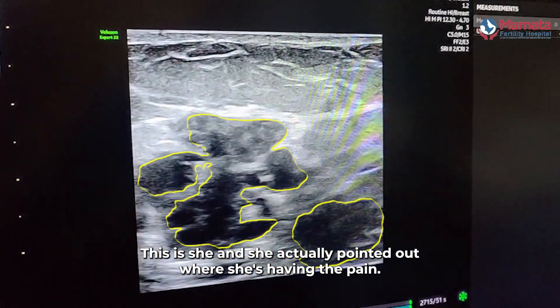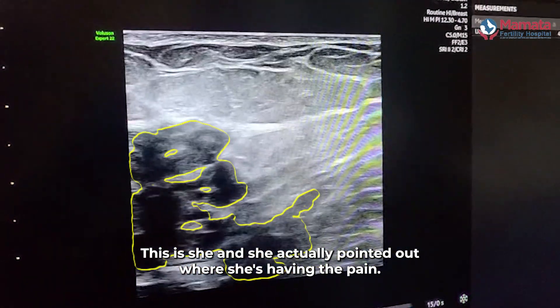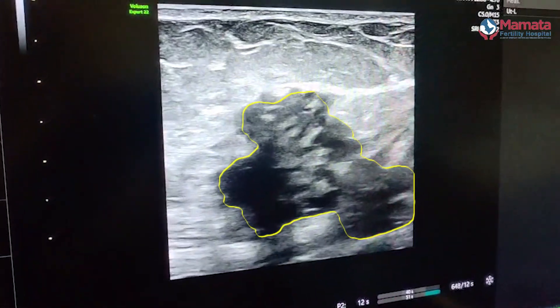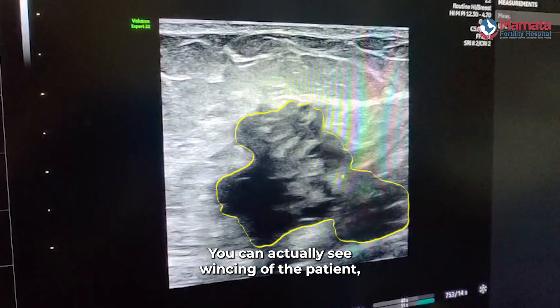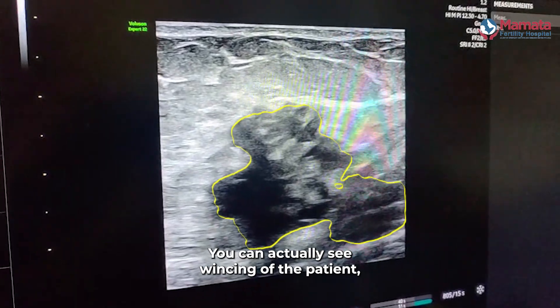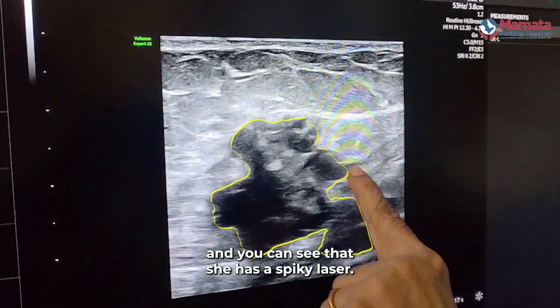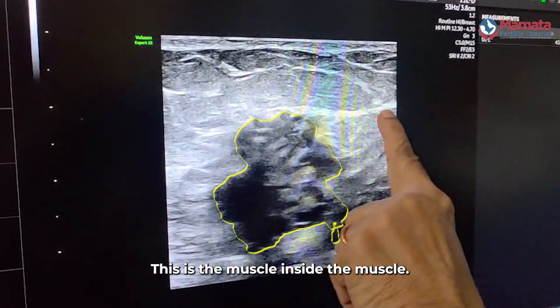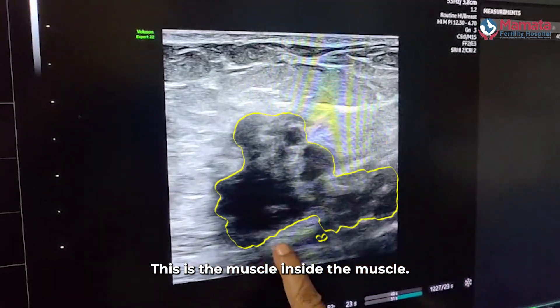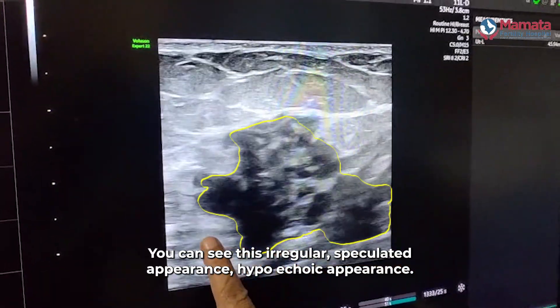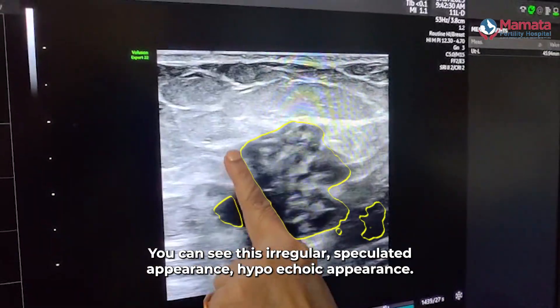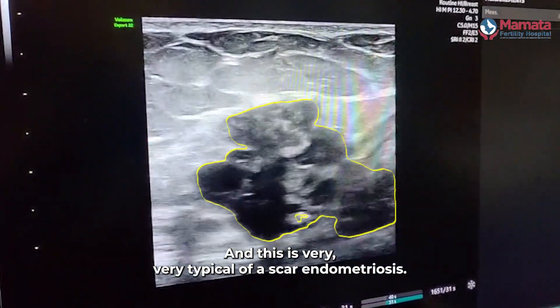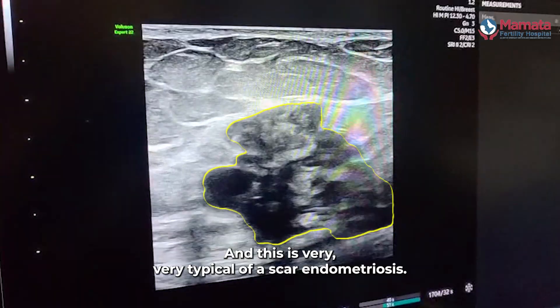Here is a patient who has pointed out exactly where she is having the pain, and you can see at that precise point she has pain — you can actually see wincing of the patient. This is the subcutaneous tissue, this is the muscle, and inside the muscle you can see this irregular spiculated, hypoechoic appearance, which is very typical of scar endometriosis.